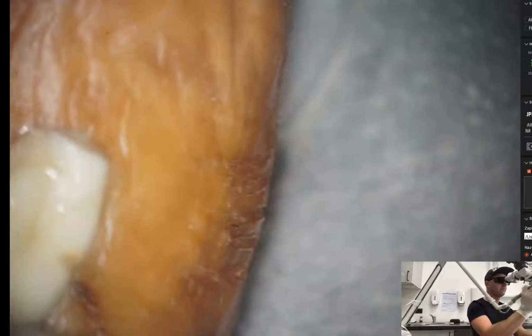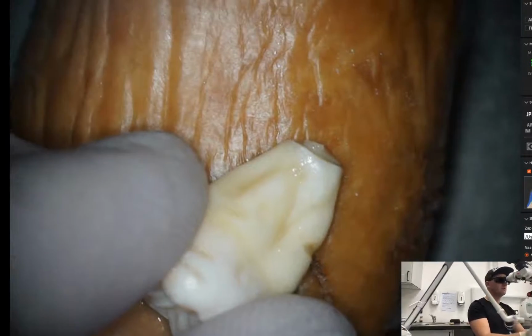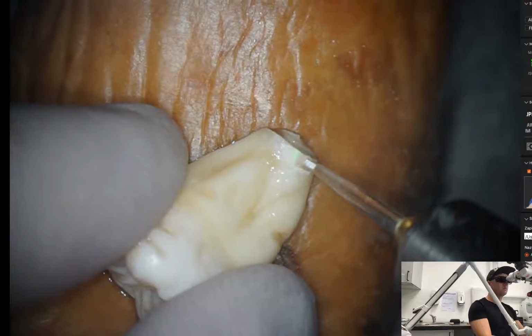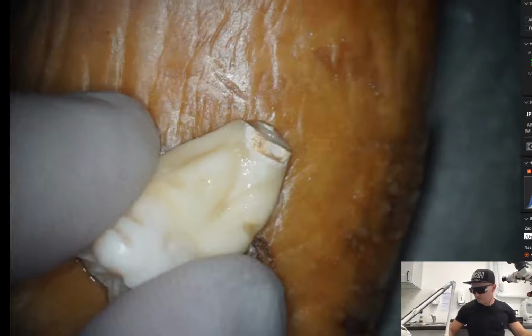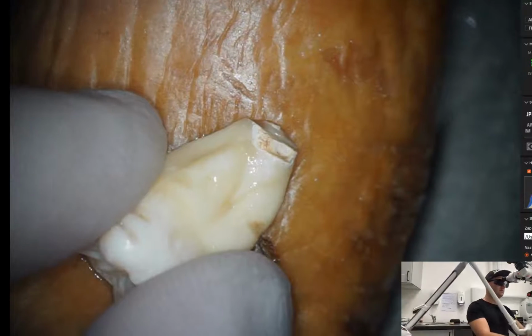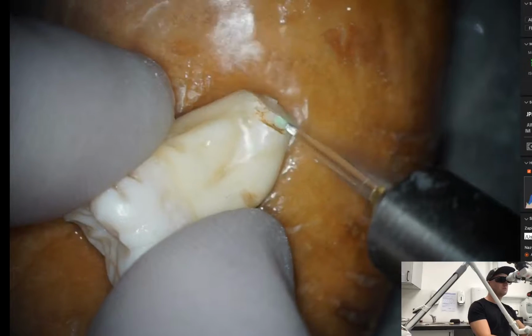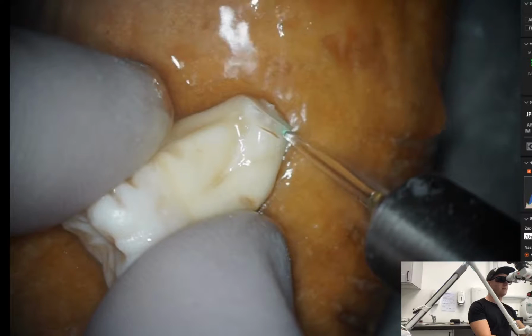For example, when we take our hard tissue like here, and we can go with apicectomy, see what happened without cooling. So that's why we have to give some additional water in ablation process to do it right.